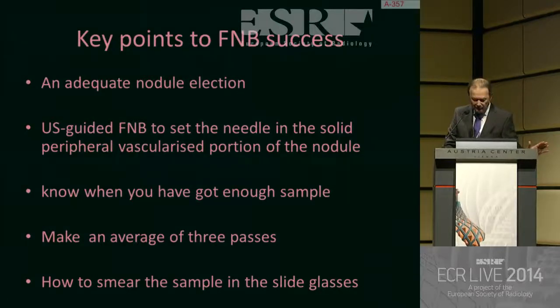In my experience, it takes an average of 3 passes. And it's very important to know how to smear the sample, because if you don't, even if you do all the previous steps right, you don't get sufficient cytological material for cytological analysis.